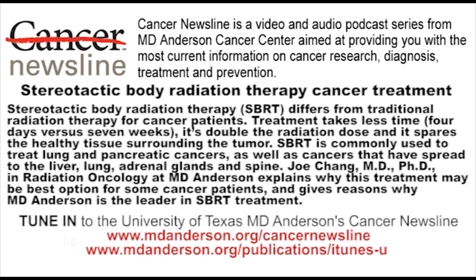radiation therapy. The third group is patients who have a different type of cancer, but the cancer spread from primary, either colon, rectal, or pancreatic cancer, sarcoma, or melanoma. They spread to the lung or liver or adrenal. We can treat with stereotactic radiation therapy or SBRT using this technique. So basically, cancers that are in the thoracic region, it sounds like. Thoracic or liver or even adrenal.